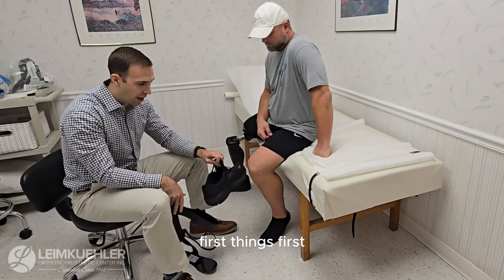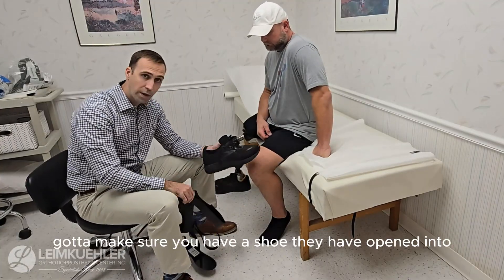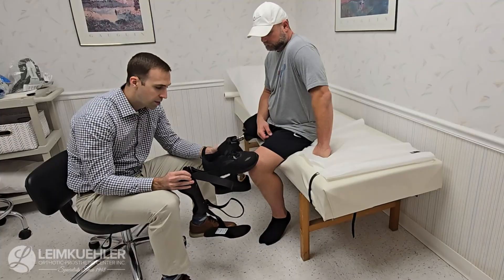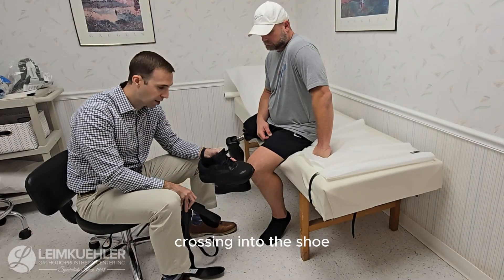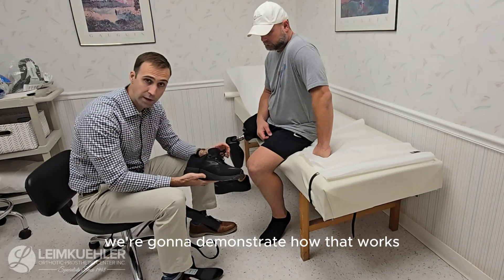First things first, you have to make sure you have a shoe that the AFO can fit into. Orthotists can obviously grind and cut this. We've already set this up to fit correctly into the shoe. We're going to demonstrate how that works.